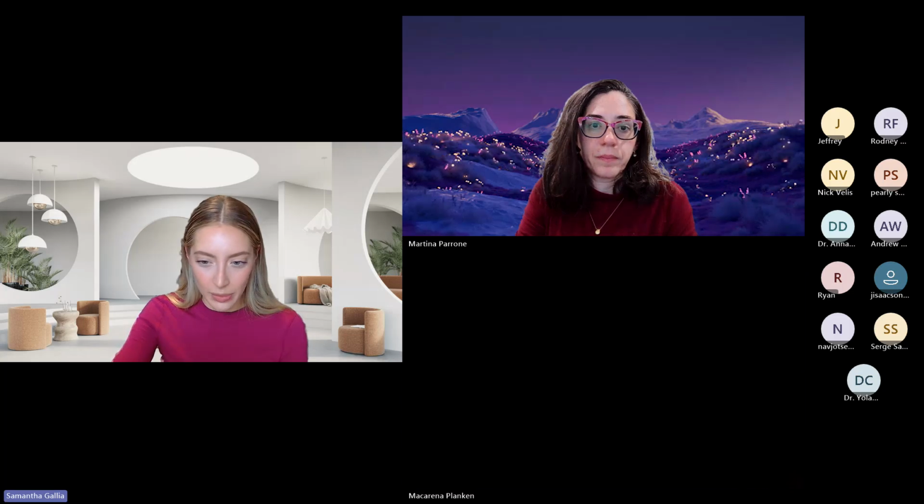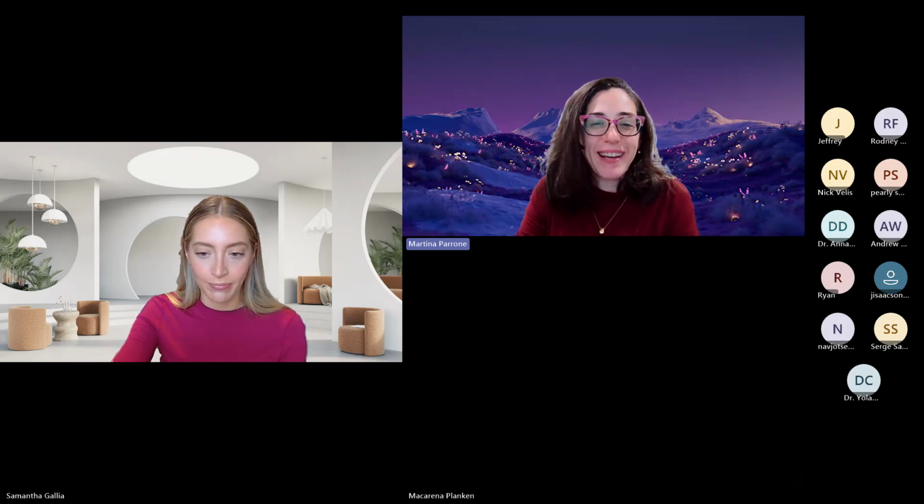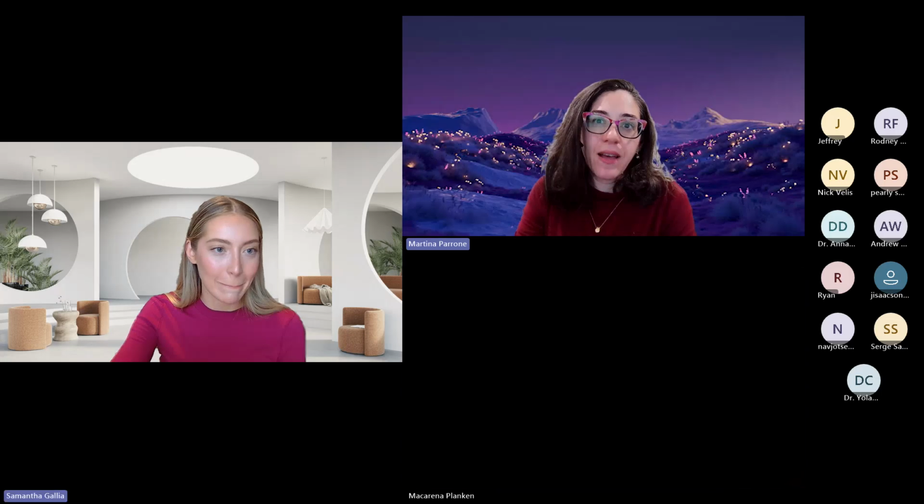Any thoughts on that, Martina? I agree with everything you said. I did my master's on vertical root fractures, and if there is not separation, you will not see it. One thing to keep in mind, though, is bone loss happens relatively quickly with it.